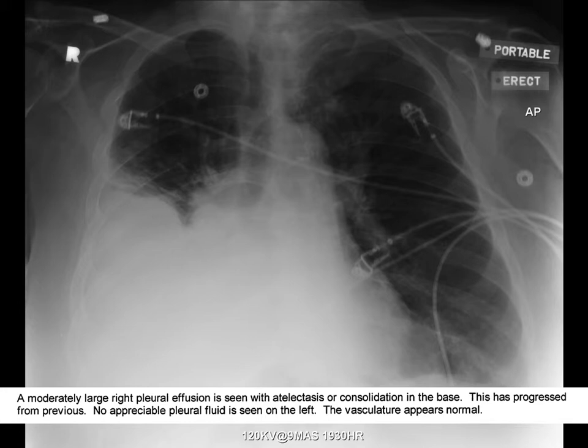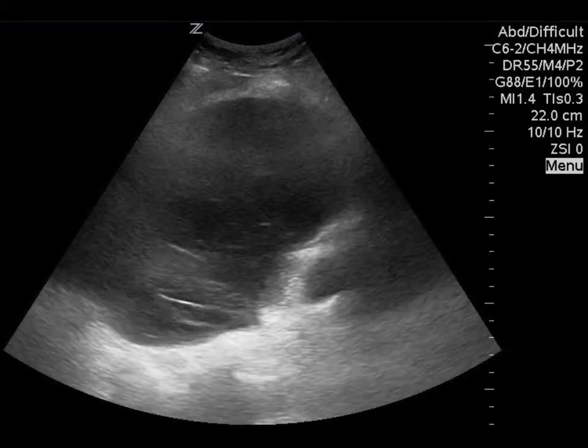Okay, so I know I said that we weren't going to really talk about pleural effusions, but I couldn't let this one go, just because it had so many smaller teaching points. So this patient, when I saw them, I thought, well, I've got to know what I'm looking at. I'm going to put the probe on. And so I put the curvilinear probe, mid-axillary line, trying to get the diaphragm in the middle on the right side. And this is the view that I got.